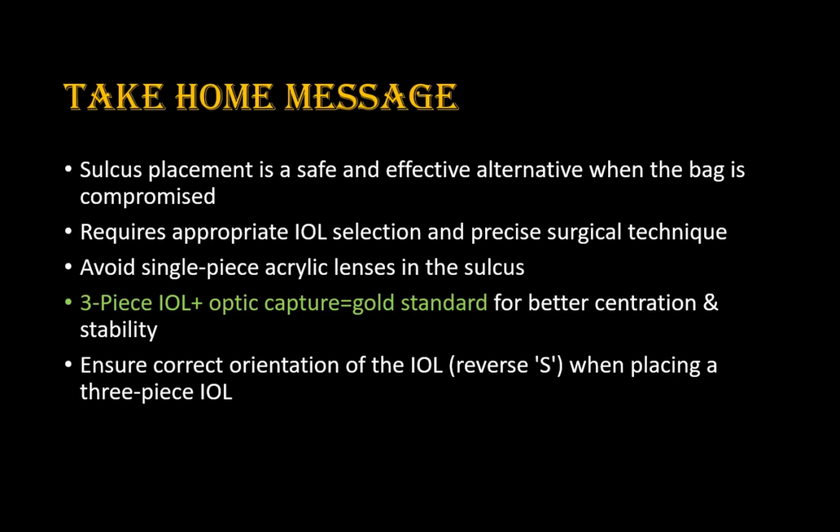And as you saw, always look for the orientation of the haptic. When you are placing a three-piece IOL, it should be in a reverse S shape, because there will be some angulation in a three-piece IOL. So it will always have a tendency to come upward and cause optic capture.